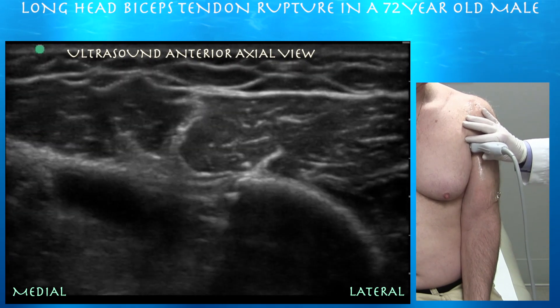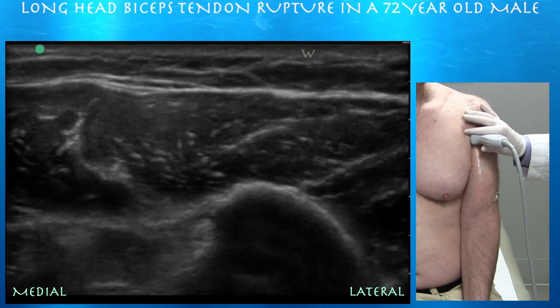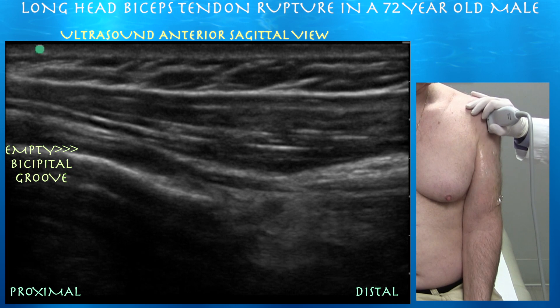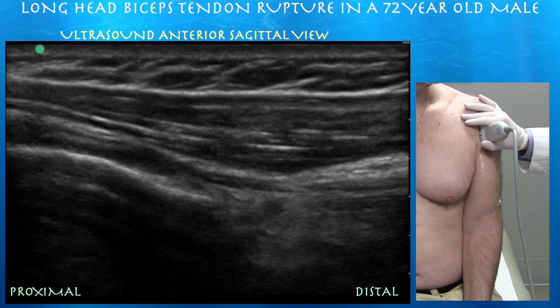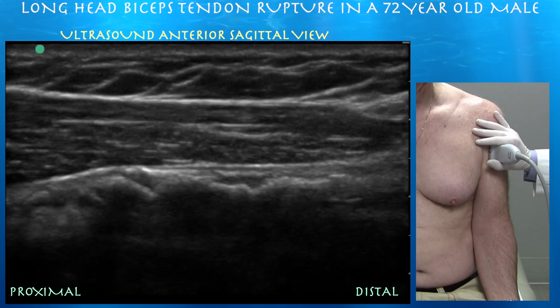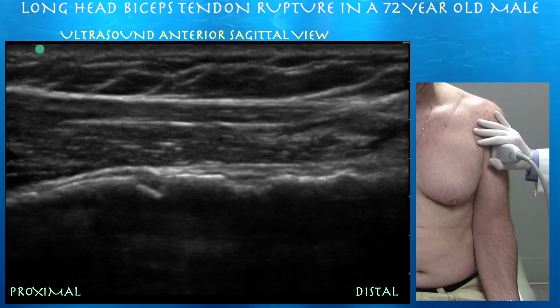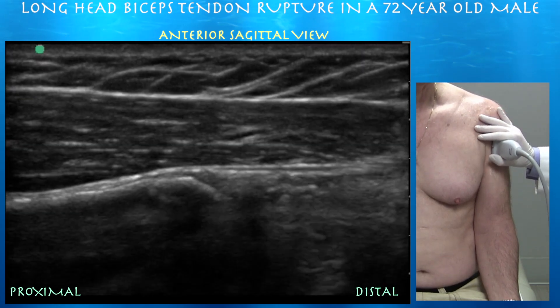Here you can see part of the biceps brachii longhead muscle actually under the pec major tendon. The retracted muscle is balling up under the pec major tendon. Right side of the screen is distal. Again, I just see empty space where you would expect biceps. We're getting into the longhead of the biceps, and here's what I believe to be some of the retracted tendon, bunched up and forming refraction shadowing with hyperechoic irregular lines.